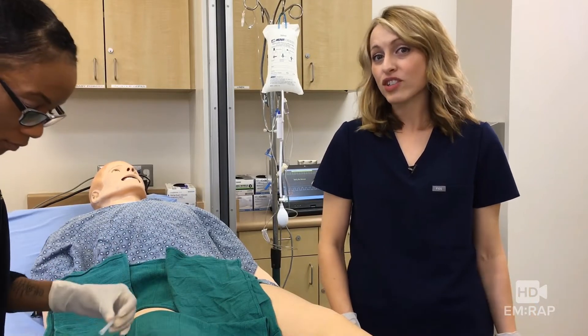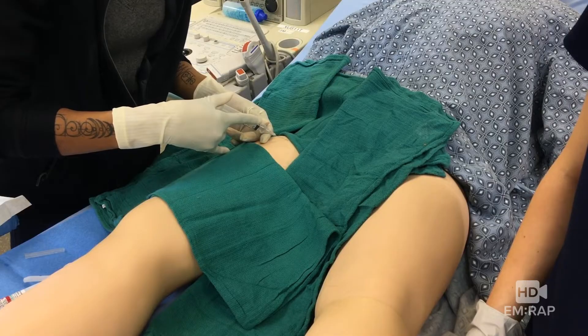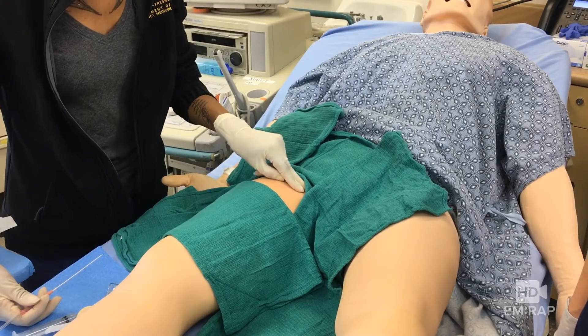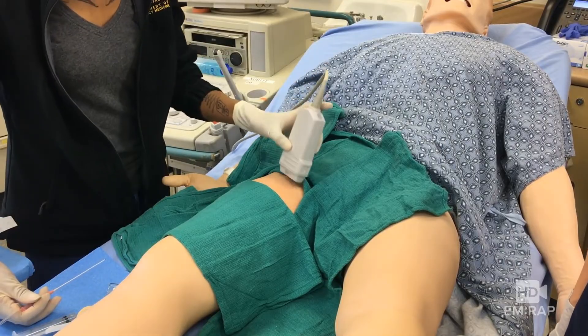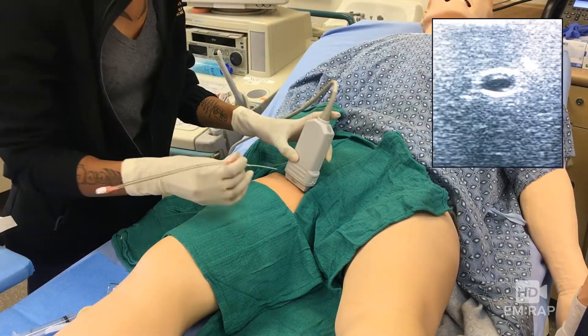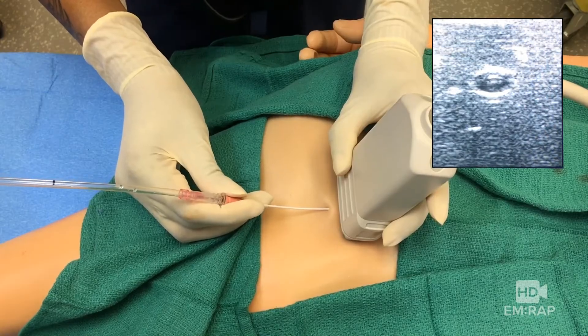Now I think we're ready, so let's inject a small wheal of lidocaine. Palpate the vessel with two fingers, and if you have an ultrasound, now's a good time to use it. Approach with the angiocath at 45 degrees. When you get flash, stop.